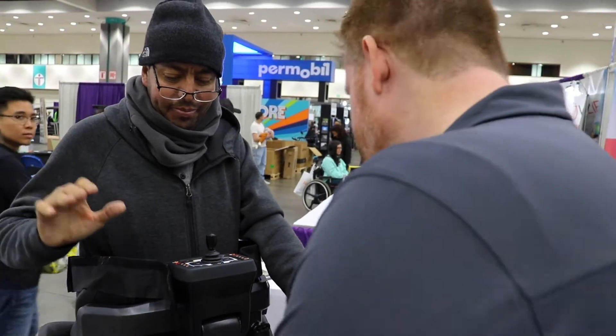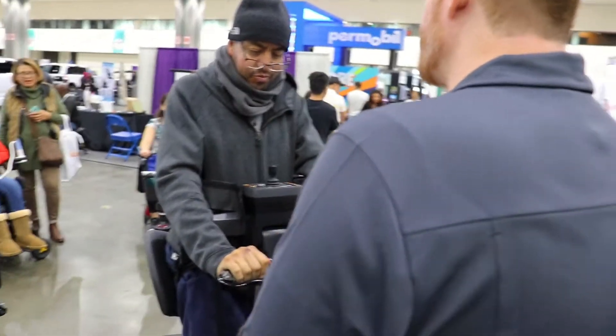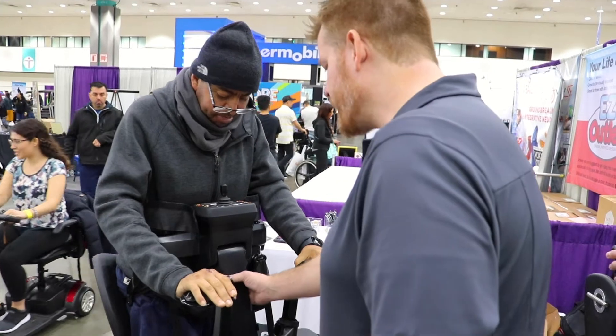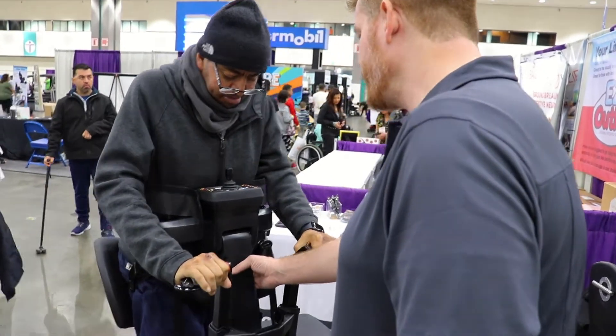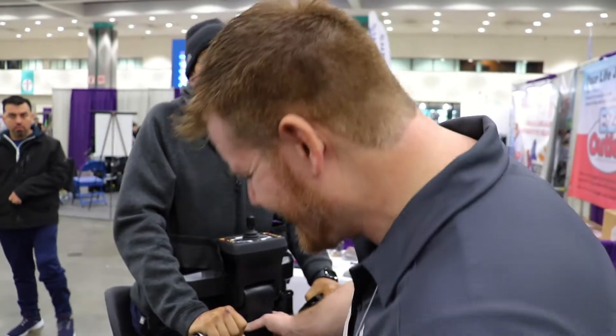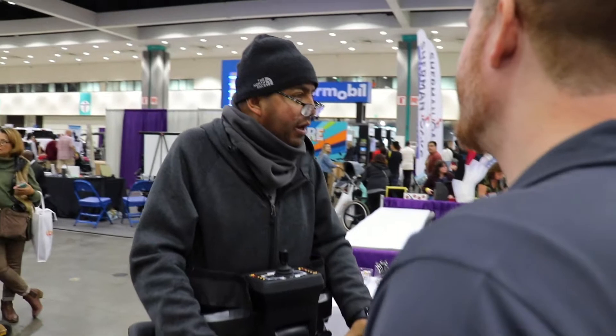Let go of the lever here, we'll let go of that. So when you're grabbing on, just grip on the grips. You can come up a little more if you wanted to. If you're comfortable right there, you're fine. A little bit more? Okay, go ahead and squeeze that there and just pull yourself. There you go. Even better, man! Woo! Perfect.